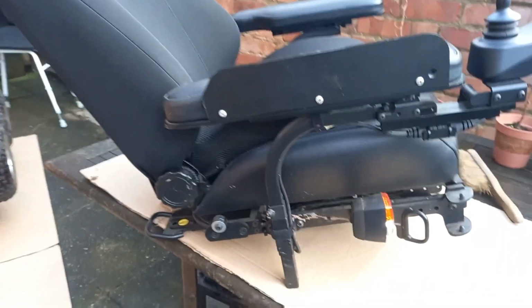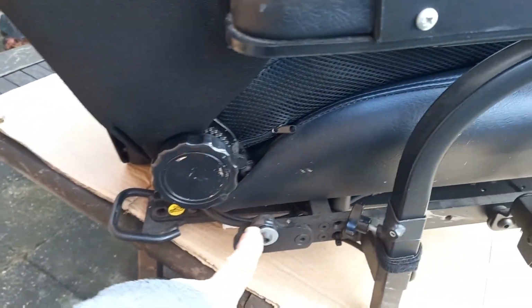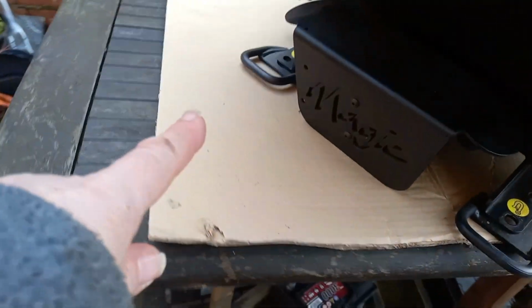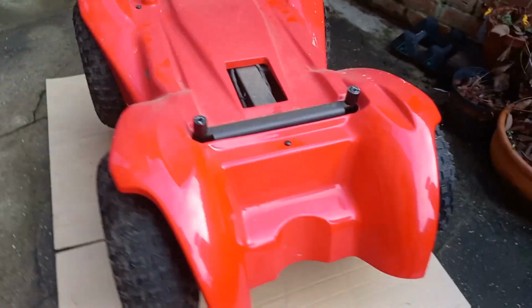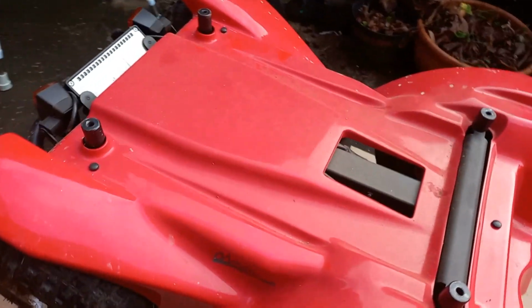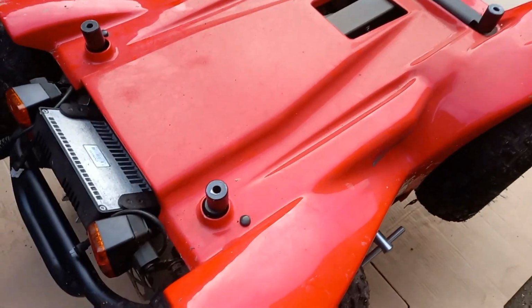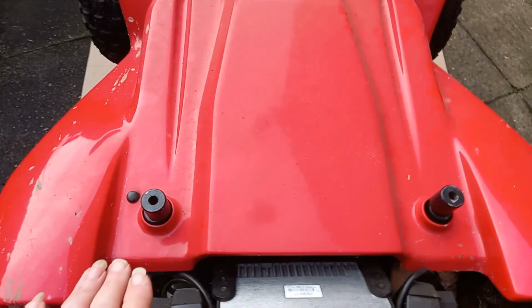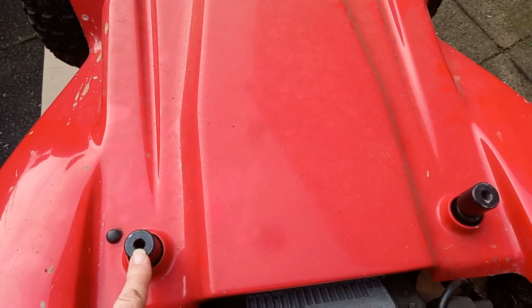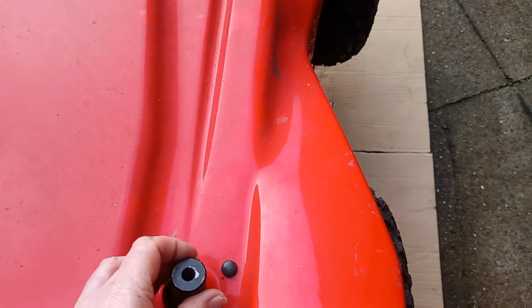Seat is now off with the indicators still attached. All we did was disconnect the indicator wires and the wire from here that goes down to the power bank, and there it is without the seat. The batteries are underneath here, so we've now got to get the plastics off. The only little thing I'm worried about is when we put the seat back on, they've got to line up, because there's like a piece of metal sticking out.